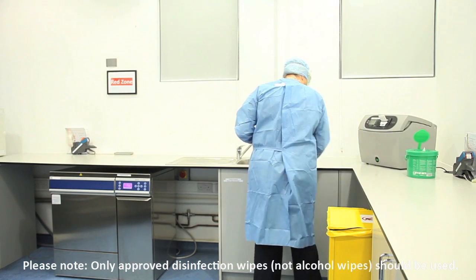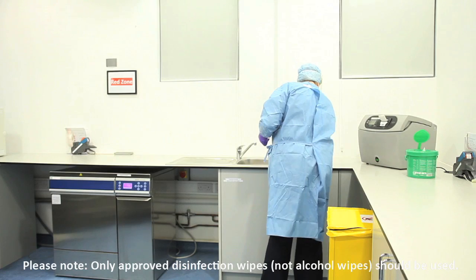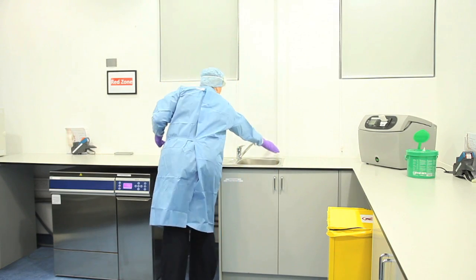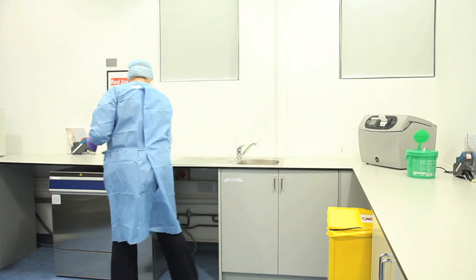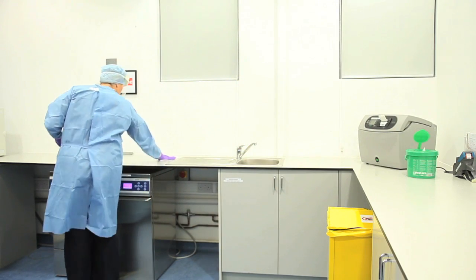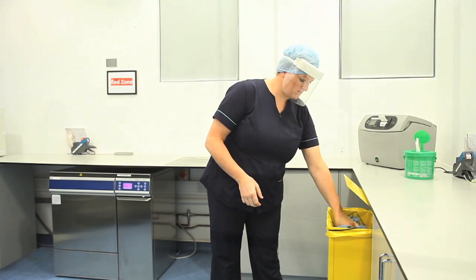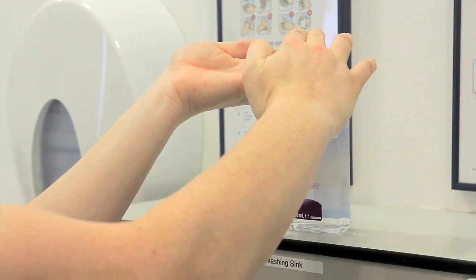Before moving to the next zone, the dental healthcare worker disposes of all PPE which was worn in the red zone into the healthcare risk waste bin. If wearing protective glasses, these should be removed and disinfected with suitable disinfectant wipes. The dental healthcare worker then carries out hand hygiene.